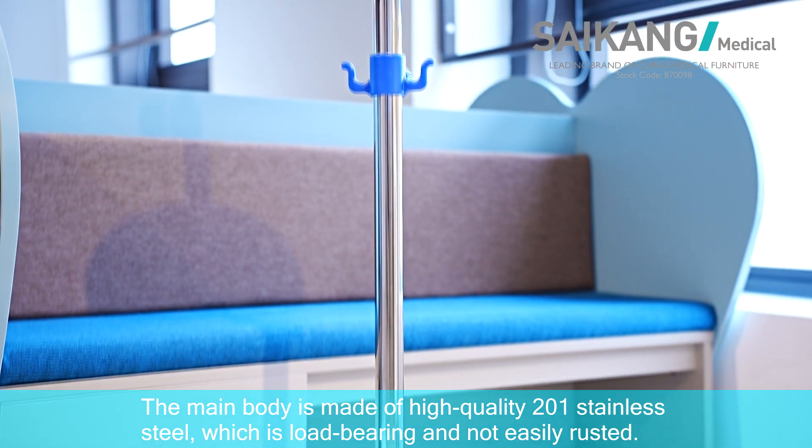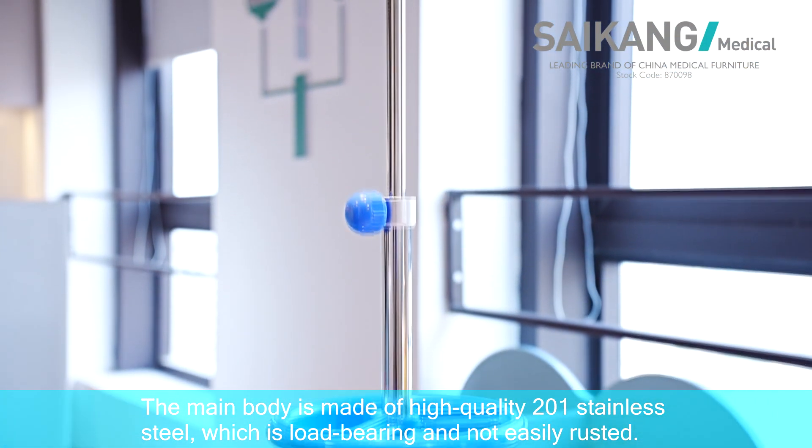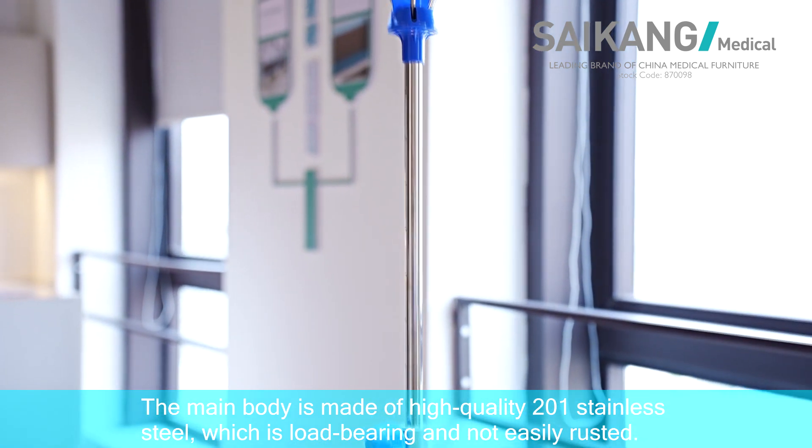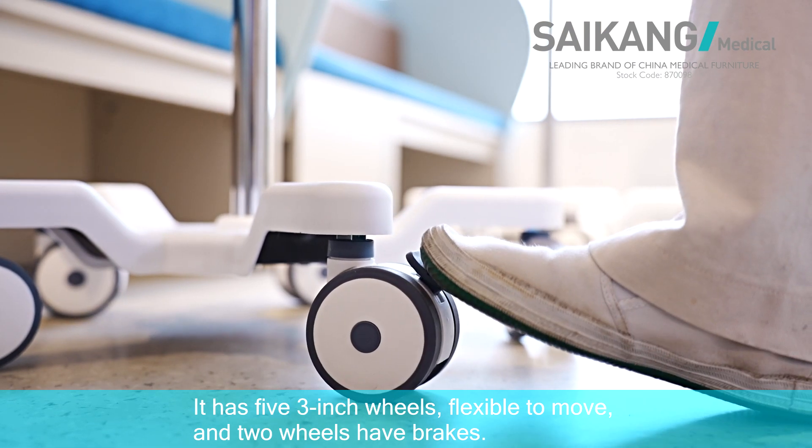The main body is made of high-quality 201 stainless steel, which is load-bearing and not easy to rust. It has five 3-inch wheels, flexible to move, and two wheels have brakes.